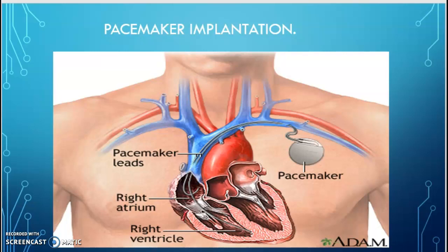Pacemaker implantation. In this section is just the basic value of how you implant it. This is a diagram of how the pacemaker system looks. The image shows the patient was implanted with a dual chamber pacemaker. The first active lead is implanted and screwed into the right ventricle, as we can see, following the blue vein down into the heart tissue, into the right ventricle. The second lead is directly connected into the right atrium, or, to be more specific, we like to put them into the right atrial appendage and the right ventricular apex.